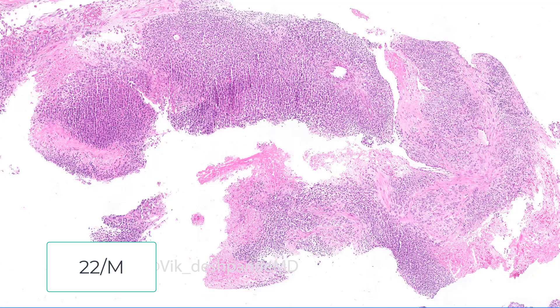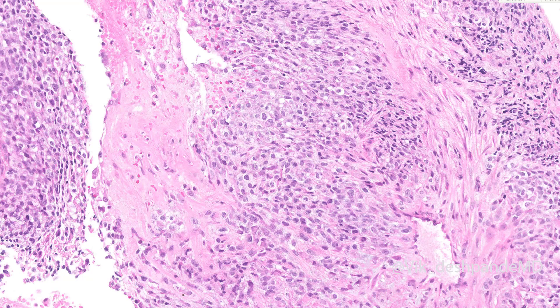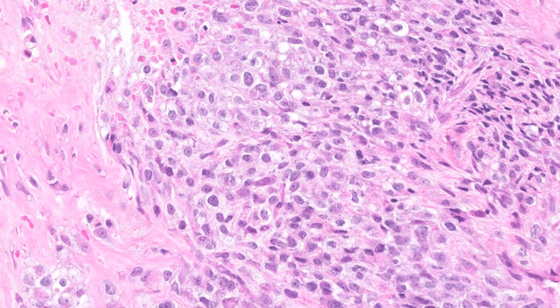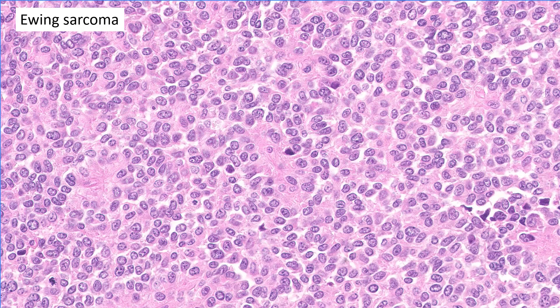Here's a mass in the thigh of a 22-year-old male. Under low power it looks like a malignant round blue cell tumor, but this tumor does not quite look like classic Ewing's. The cells are perhaps a little larger, with vesicular nuclei, little prominent nucleoli, and they are even a bit spindled — definitely somewhat oval nuclei. Could this be Ewing's? It could be, but you must explore other options at this point.